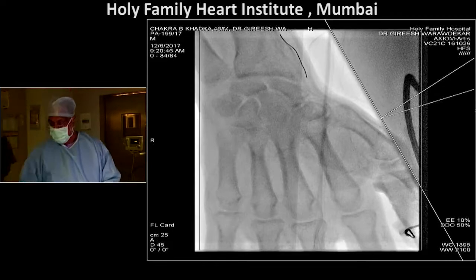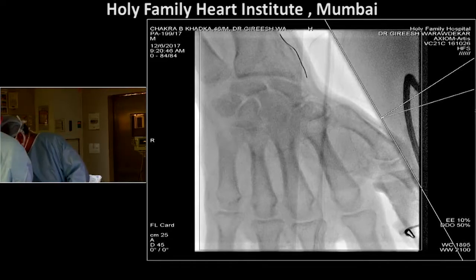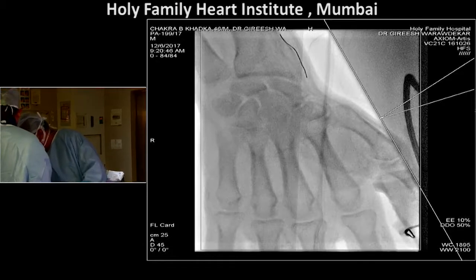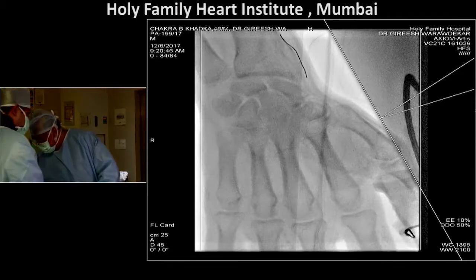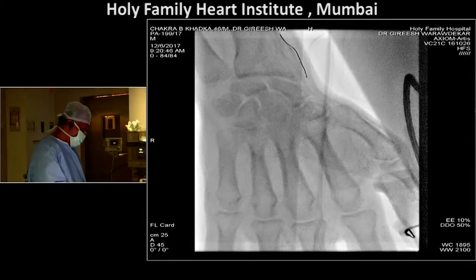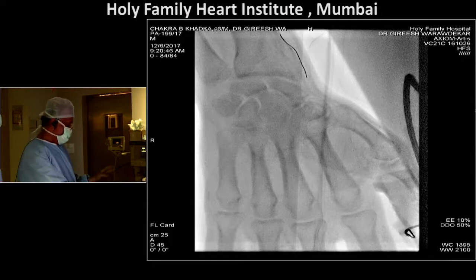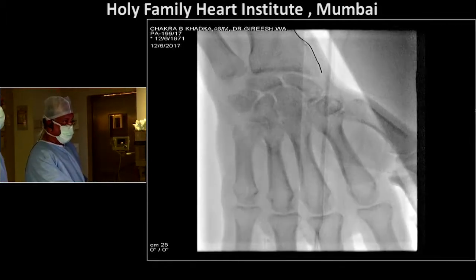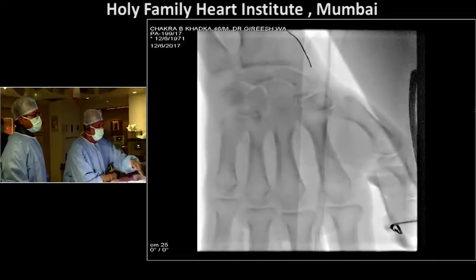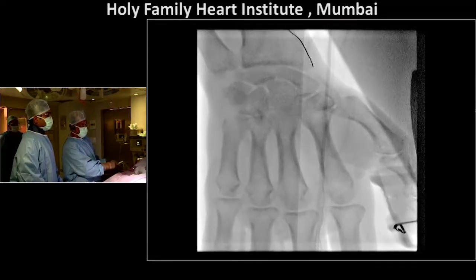We find that heparin dosing is so variable that in this case you may have 300 or you may have 150. You really want to make sure you're therapeutic. Perfect. So at this point, continuing with the heparin dose is always worth it. And you've seen the various measures taken to relieve the spasm here.